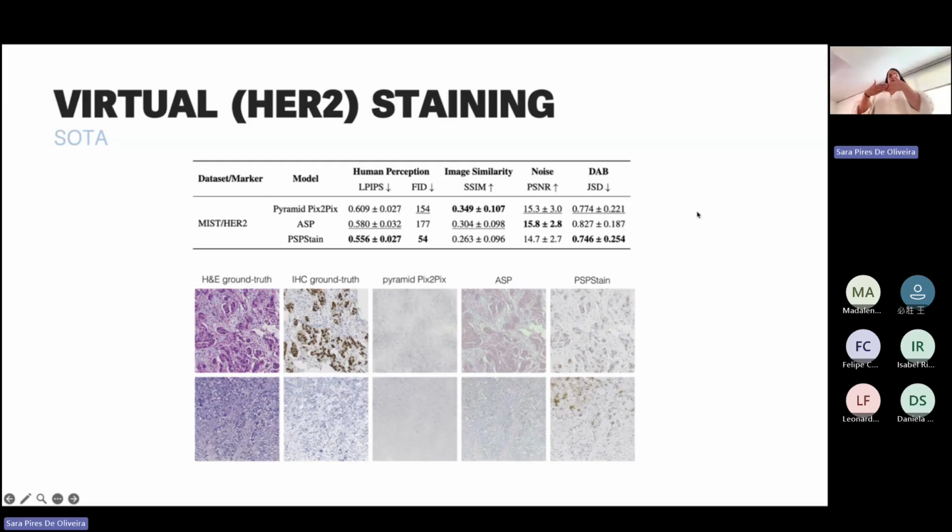And so the brown is where you can check the marker expression. And so this distance is basically what you want to have represented in the image correctly for the marker evaluation, of course. And so we basically just evaluate the distance between the original and the generated image at this level.